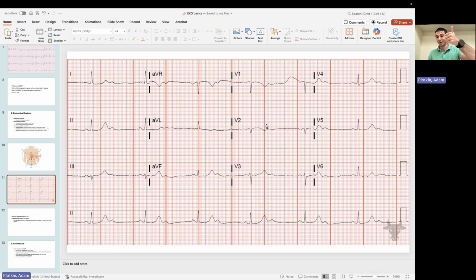Okay, let's say we had an example where lead 1 was pointing up, but in lead AVF, the R wave was definitely pointing down predominantly throughout the lead. So then I put my right thumb down and I put them together. What are my thumbs doing? This thumb's pointing up, this thumb's pointing down, so my thumbs are leaving each other. They have left each other. So that's left axis deviation.